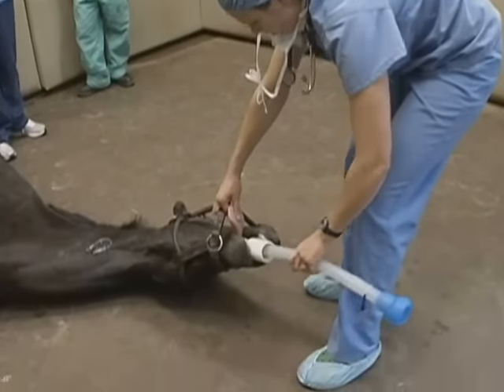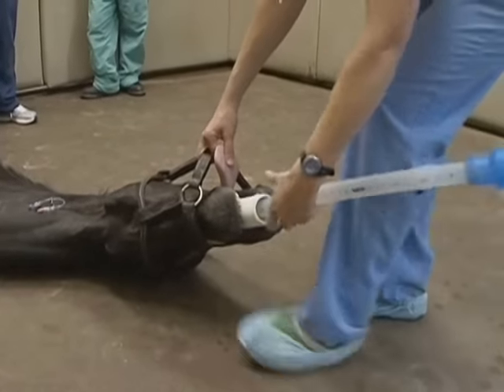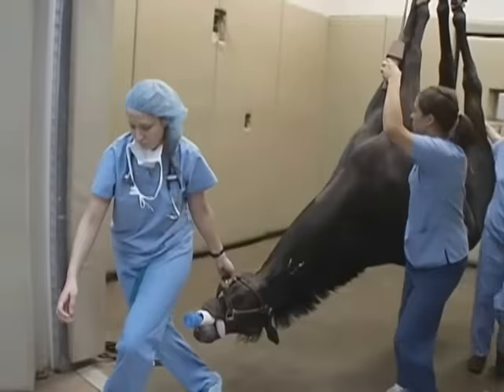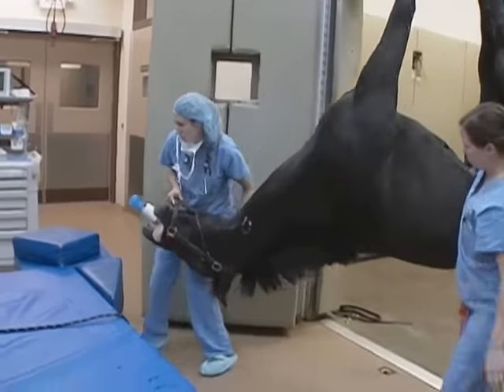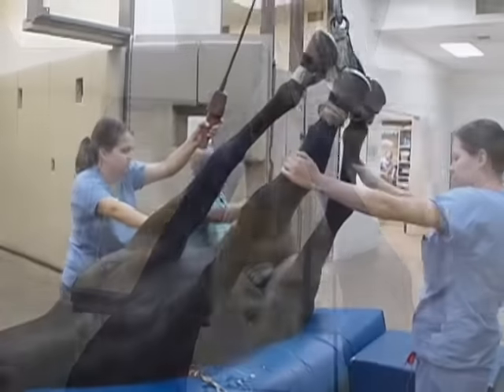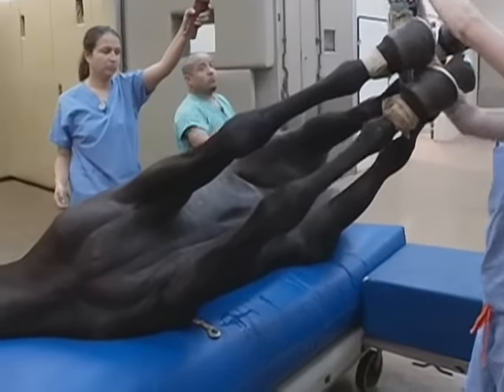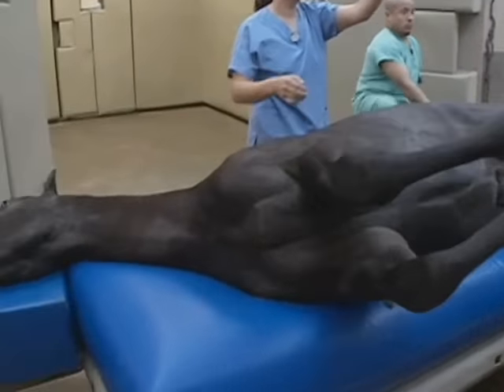Once the horse is in recumbency, we can place the endotracheal tube, which is a tube that goes through their mouth and into their trachea. Then the horse will be hoisted by its four limbs and placed on the operating table. It's a very safe procedure to do and it's done in our hospital over 5,000 times a year without incident.